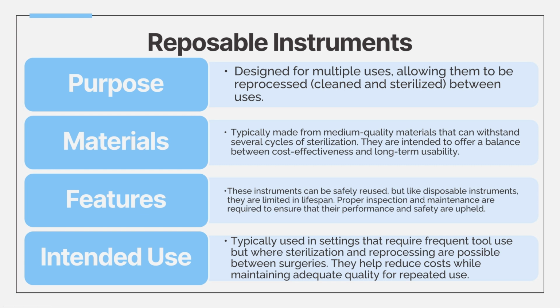They are made from medium quality materials that can withstand several sterilization cycles. They are reusable with a limited lifespan. So they require proper inspection and maintenance, and you also have to ensure that you're not using them above the lifespan as mentioned. So let's say you receive a Da Vinci Systems instrument. They are typically used, I believe, 20 times before you have to dispose of them.